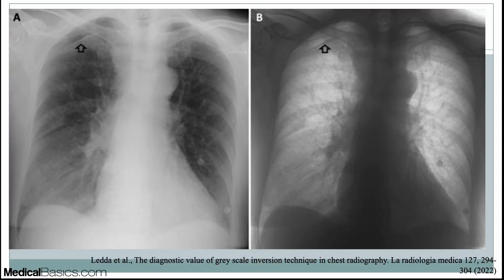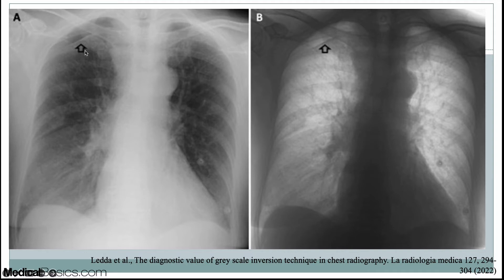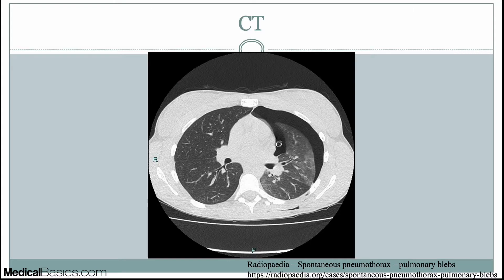A useful strategy is inverting the image — anything white becomes black and vice versa. I always look first on the normal image and then invert it. Sometimes things that weren't visible initially pop out and become much more obvious. I also use this for fractures: sometimes fractures look a lot more obvious when you invert the image, and this applies beyond chest x-ray — feet, hands, and other bones as well.